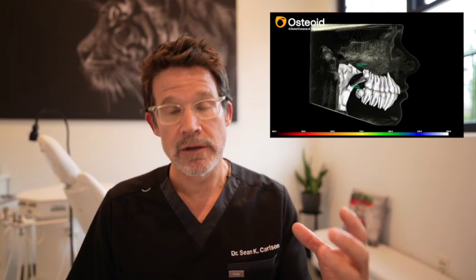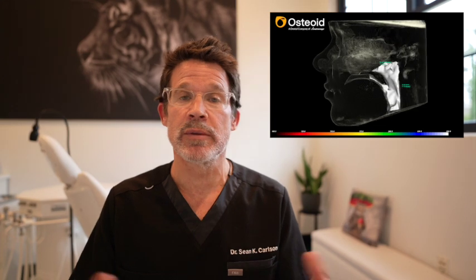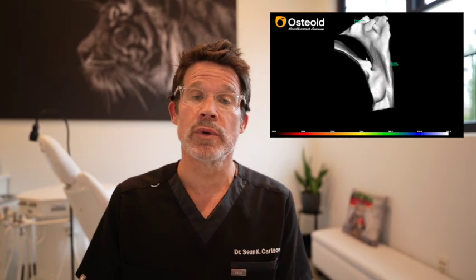And not only can you visualize structures that previously were very difficult to see on a 3D CBCT image in its raw format, but you can move the teeth into simulated treatments. So it's a way to teach patients how your orthodontic treatment is going to play out. Or if you're doing orthognathic surgery, it allows you to describe with visuals how those treatments are going to play out.